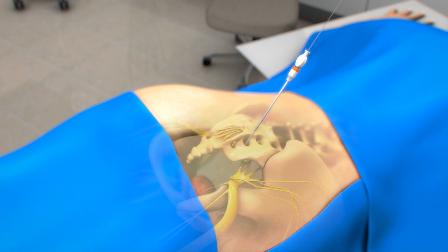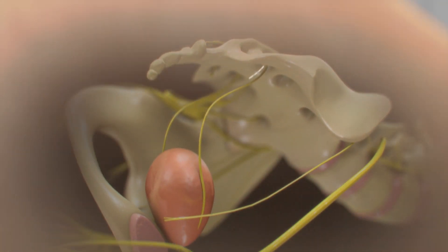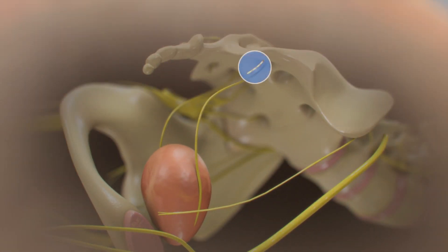The implantation process leverages similar tooling and physician training as is used in currently available sacral nerve stimulation implant procedures. An introducer dilator is placed within the S3 foramen adjacent to the sacral nerve, providing a direct pathway for placement of the Nuspera implant. No tunneling or pocket forming is required.